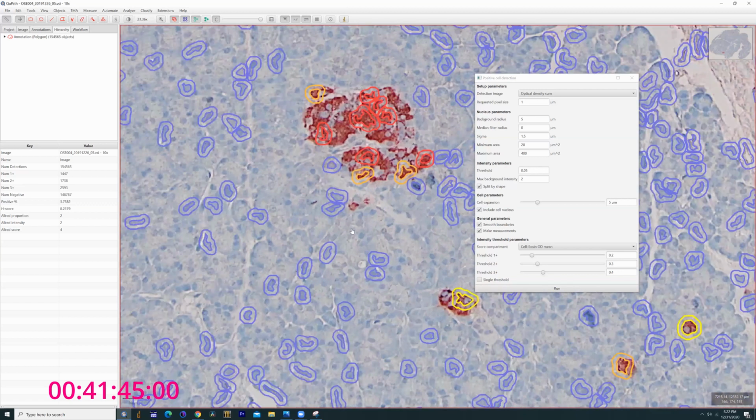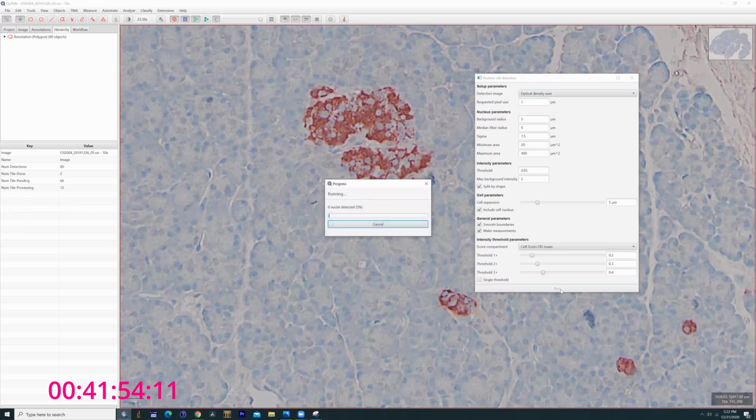But the color, let's look at the color for a second. Okay, so you can see right here where we're going. What I was missing here was the reds, blues, the greens, and so forth. Let's try rerunning this with the conditions and clean it up.